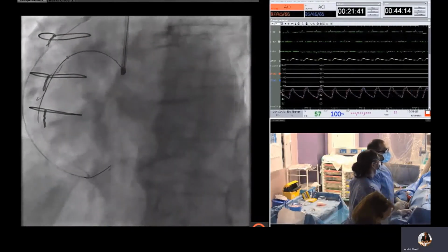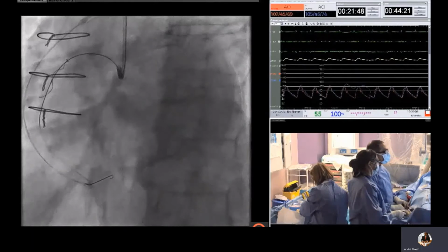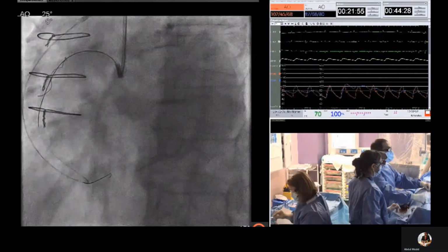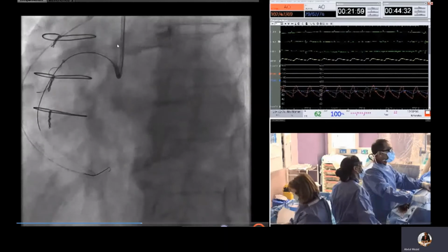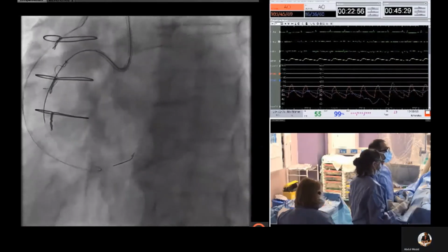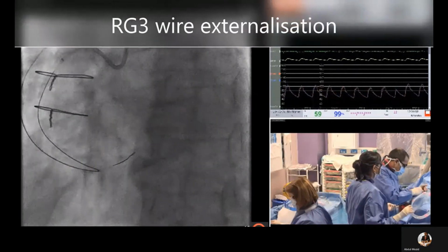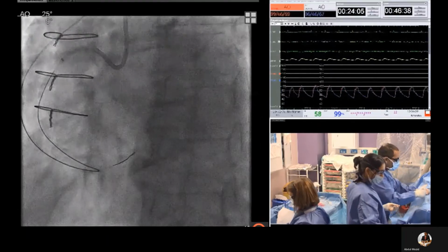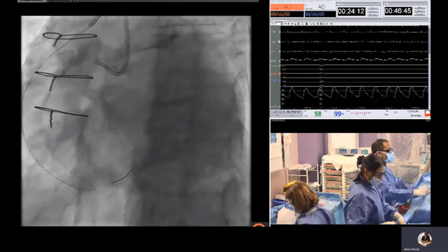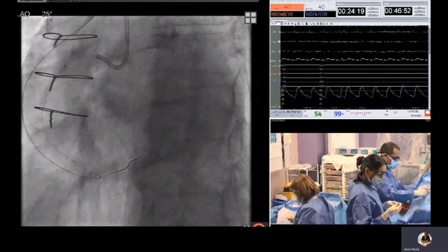The retrograde wire is then trapped with the balloon in the Antegrade guide catheter, which then allows the Retrograde Mamba Flex to easily advance into the Antegrade system, as is demonstrated here. As you can see, the Retrograde Mamba advancing into the guide. And following this, the retrograde Pilot 200 is removed and wire externalisation is performed, in this case with an RG3 wire. This is a 300 centimeter wire, specifically used for externalisation.